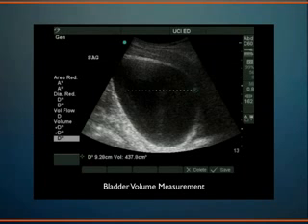It's one of the 5 most painful things I do to patients in my ER, putting a catheter through their urethra into their bladder. So I like to look first to see what's going on, to see if I've got a bladder full of urine, or if it's an empty bladder, I won't put them through that process. And also to see how well the kidneys are functioning.